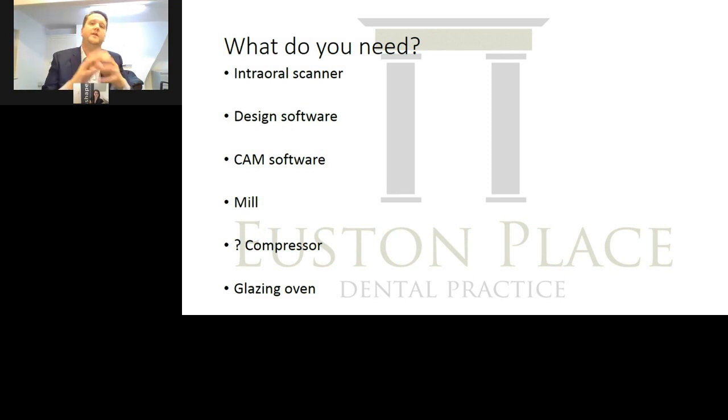So this is the important thing you need to consider, is what you actually need. So intraoral scanner is obviously a prerequisite for this. Design software, so this is where Trios Design Studio comes in. CAM software, so historically we were using a computer-aided manufacturer software that was separate before this trusted connection. Now it's all integrated into the Design Studio, which means you don't have that extra step. The mill and the compressor is a query, simply because the Roland mill doesn't have a compressor inbuilt. I know the Program Mill 1 does have an inbuilt compressor, and you don't need a separate compressor. So depending on what mill you're going for, you need to consider that it's an additional cost, an additional thing you need to know where you're going to put within your practice.